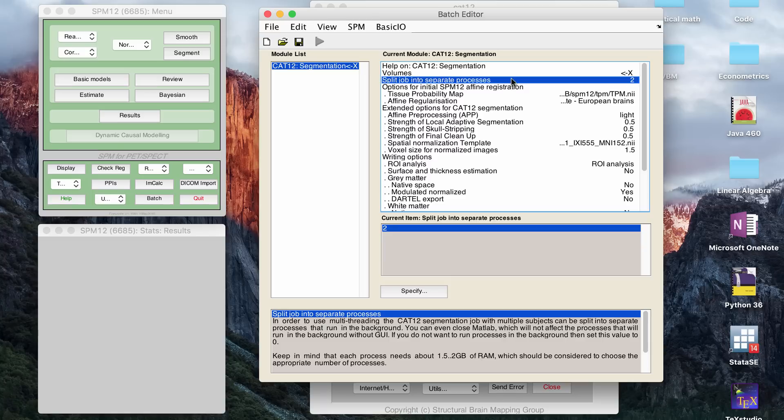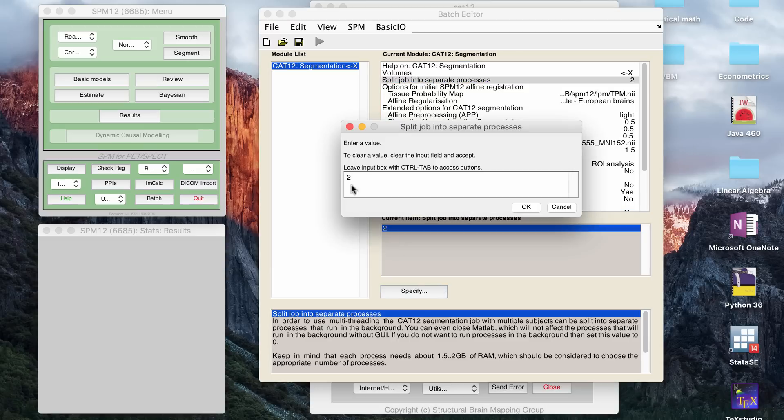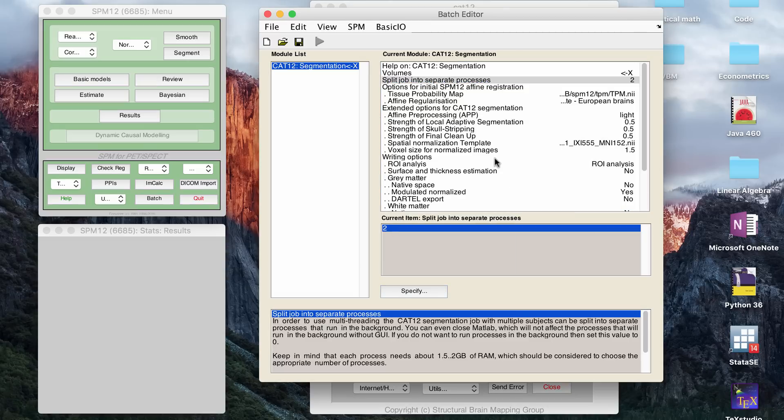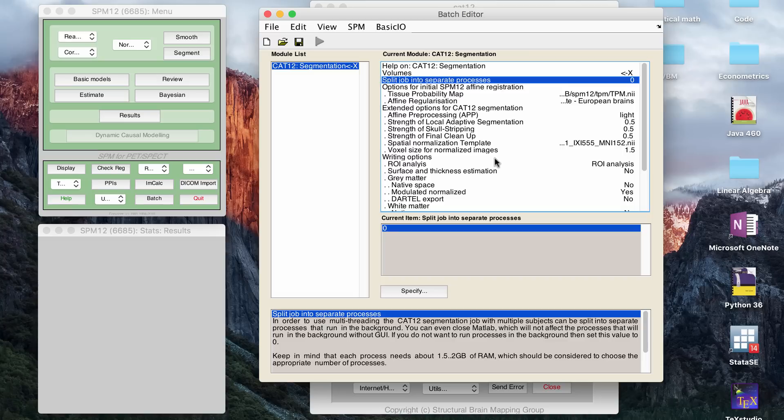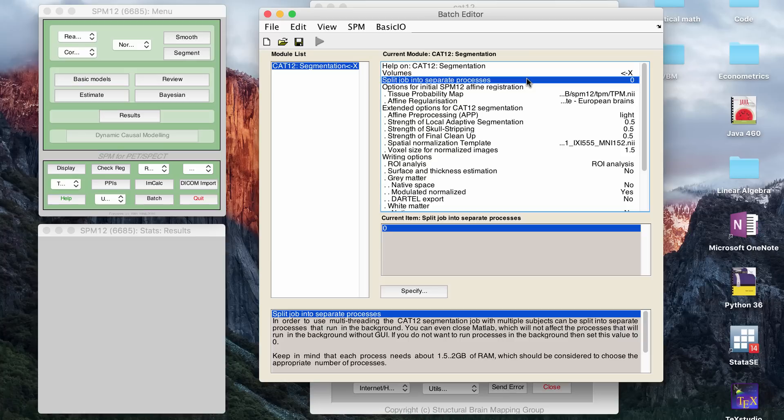This option, split job into separate processes, I think it looks at your computer, and I don't know if it looks at the threading of your computer or what, but I actually just always change this to zero because on my work computer, it doesn't work if I try to use separate cores or whatever. But if you guys know more about computers than me, maybe you know how to get that to work. So for example, it gave you an option of two. If you want to try it with the default, whatever number it gives you, if that doesn't work, then if you switch it to zero, it will work.